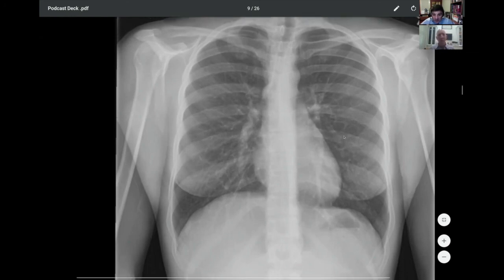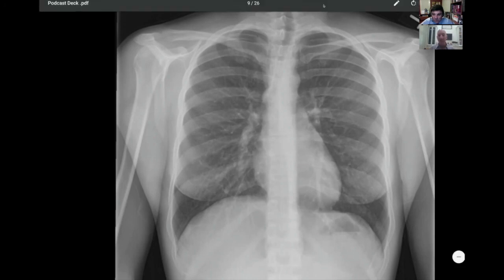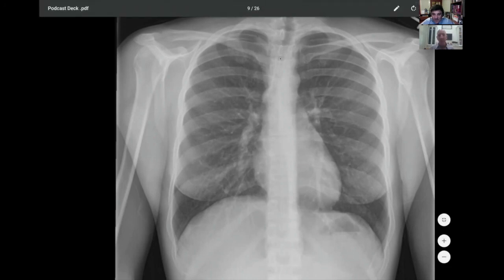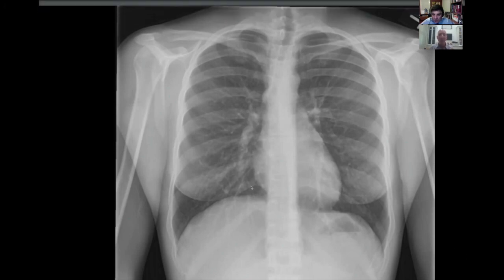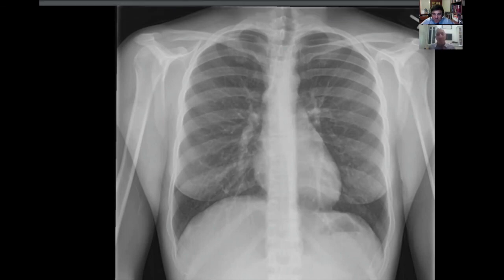But the finding was actually something that you touched on in this case. It is in fact at the thoracic inlet, where you see that trachea deviating to the left. As we discussed earlier, that should be part of the search pattern. That's not a normal finding. Sometimes it can be artifactual if the patient's head is really turned to the side and the positioning is not good. In this case, the clavicles look pretty symmetric in relation to the spine, so we have to think that this patient is pretty straight, in which case the trachea deviating to the left is the pathology there. Really?